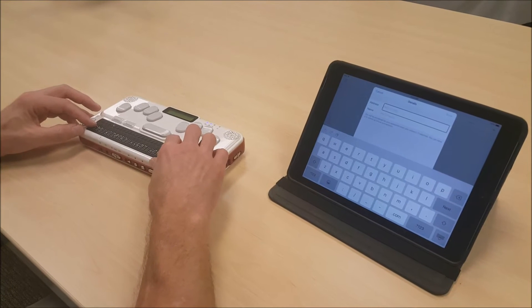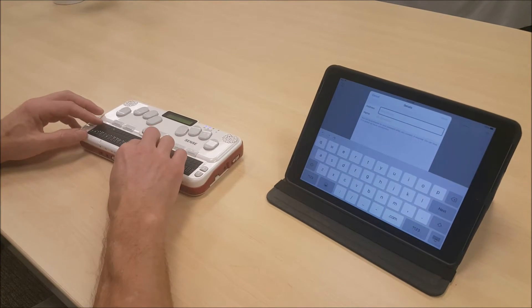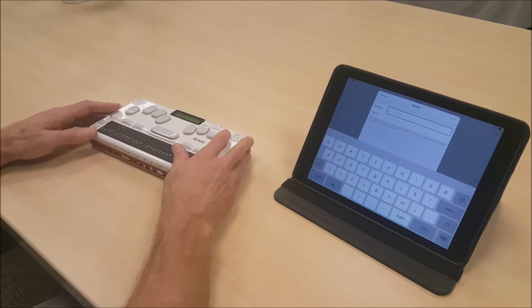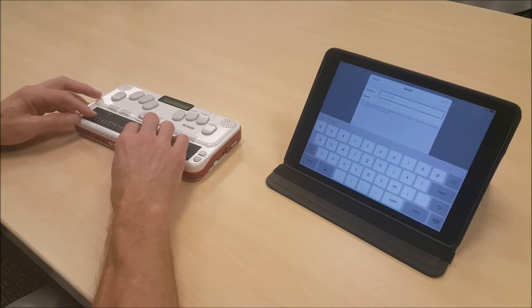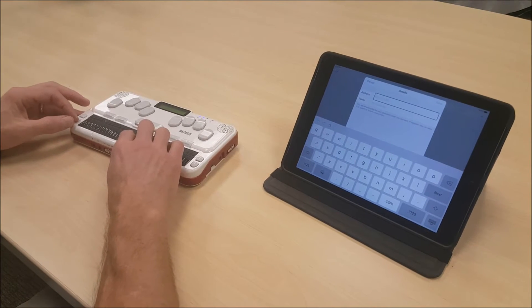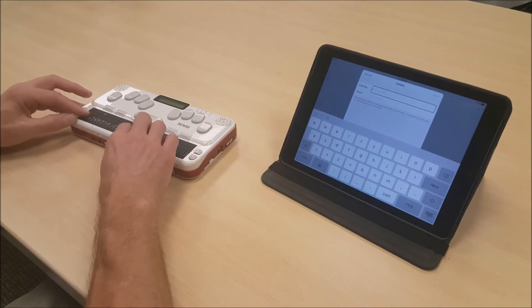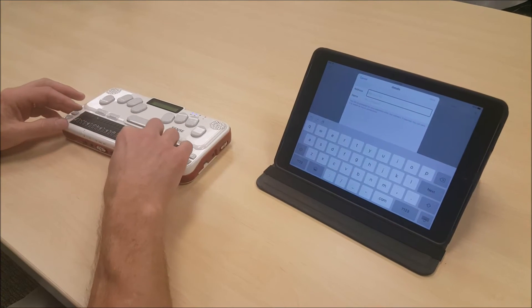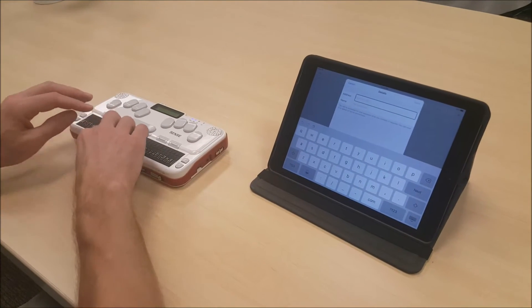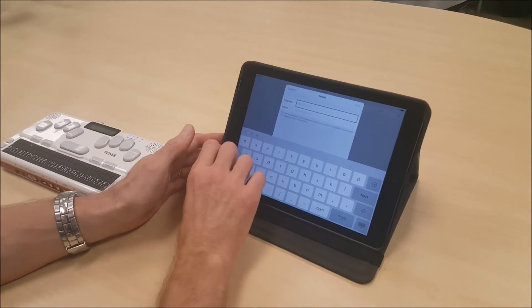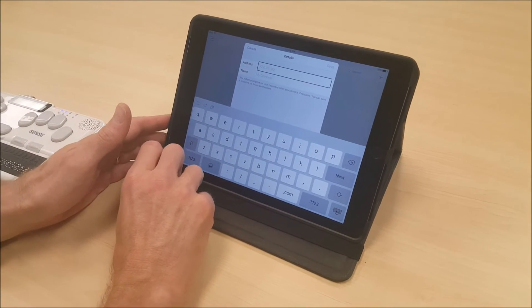In order to find the IP address, I am going to press FUNCTION KEY3 — which is also tab, or SPACE plus 4 plus 5. If I get an address that starts out with all zeros and it says Ethernet port, then I know that I need to scroll down to get my wireless IP address, because I am going to be connecting to a tablet over a wireless network. So I am going to press my scroll button down and move forward. The address shown is 192.168.1.57 on wireless LAN.